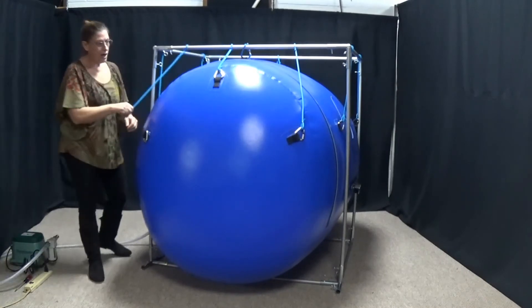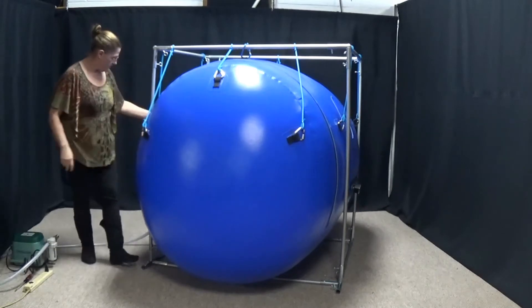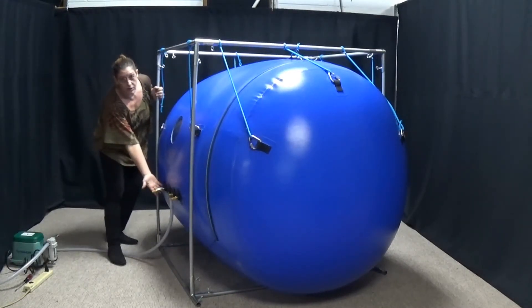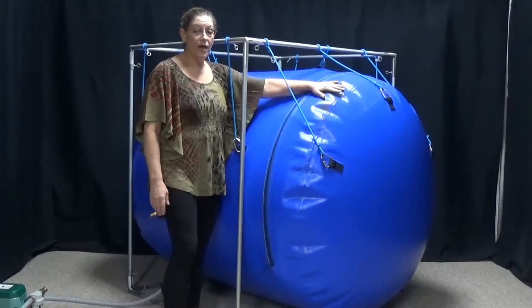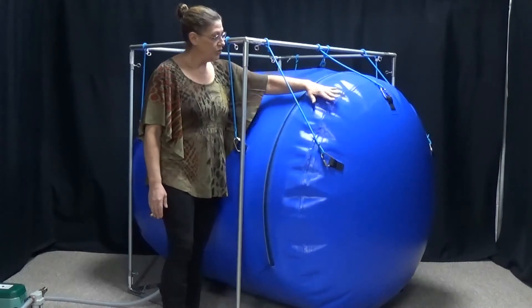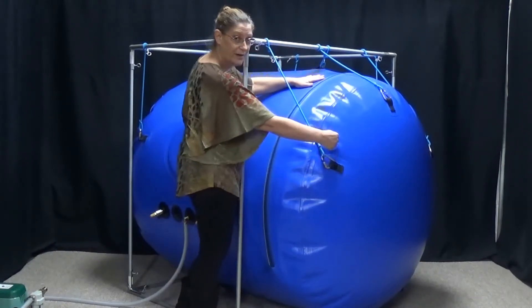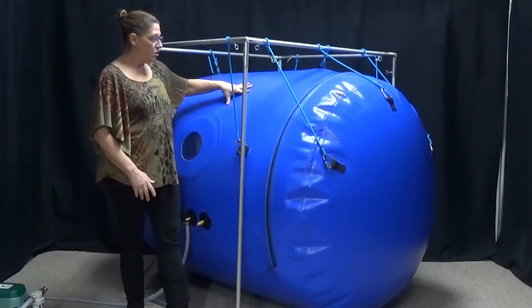I'll go ahead and turn off my compressor and allow this to deflate. On this side you have a deflate valve with a black lever on it. When it was shipped to you the lever was closed — you'll see that it goes across the silver cylinder. To open it up, I'm just going to turn that lever. Now my chamber is down to zero PSI and the material is kind of soft. Once your material is soft, the chamber's no longer holding pressure, and it's okay to go ahead and open up your zippers.